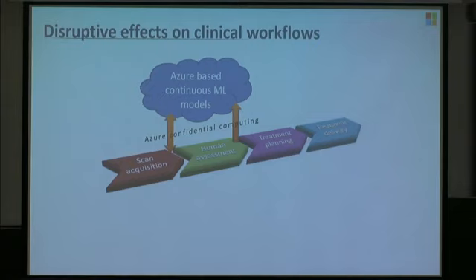But what's really interesting about this is that if you want to implement continuous machine learning, you need the telemetry. You need to know when the human assessed that segmentation, was it good enough? Did they need to change it? Because it's getting that delta, that if you can feed that back into the ML models, makes it really powerful, particularly because we're not talking about thousands and thousands of patients, typically, we're talking about hundreds of patients. And then you do your treatment planning and you do the delivery. So next month, we'll be able to do this in the department, which is just fantastic.